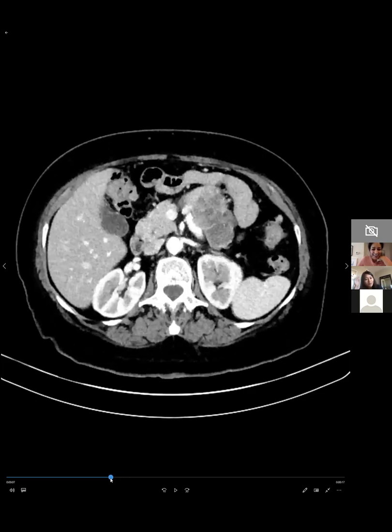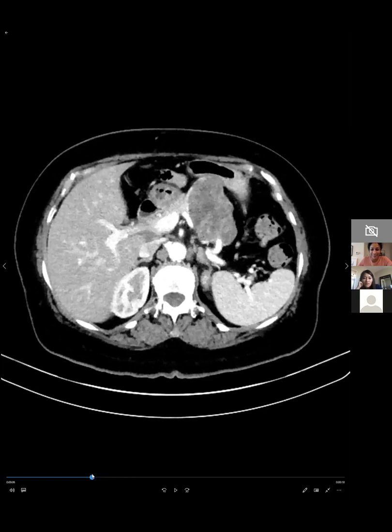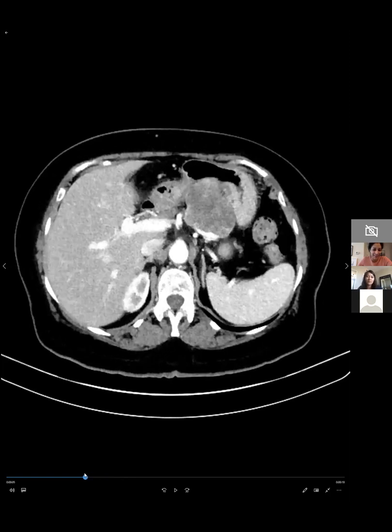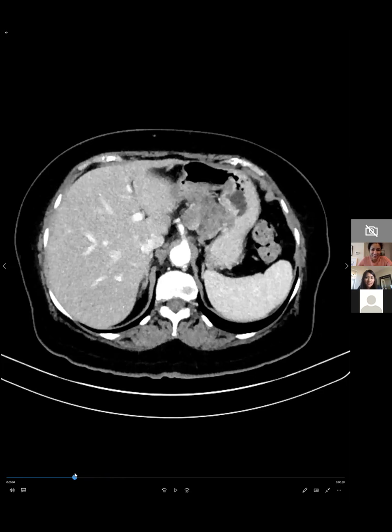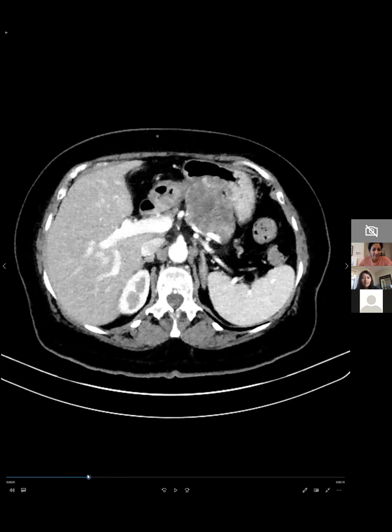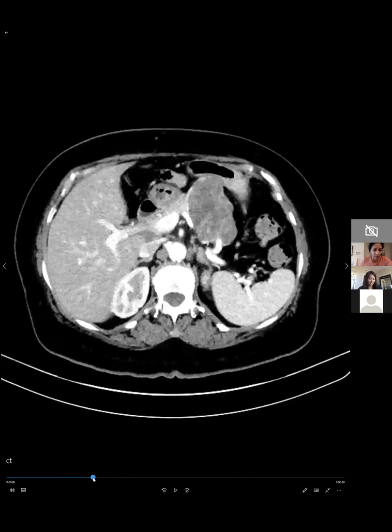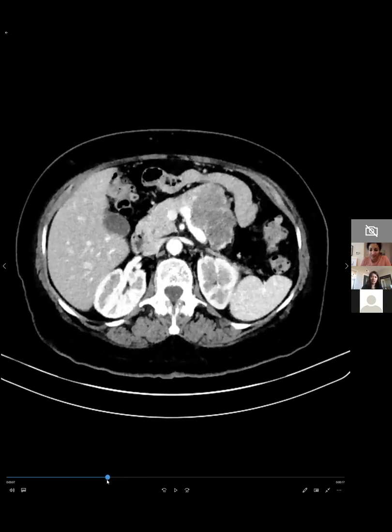There's stranding in the mesentery. Anyone online aside from Nelly and Gaurav who want to chat in your guesses? It's really close to the stomach. Do you have the coronals? I don't, I'm sorry. So Nelly's thinking maybe from the stomach. Go scroll through. It also looks like it has a claw sign with the pancreas right there. Yeah, explain the vessels.